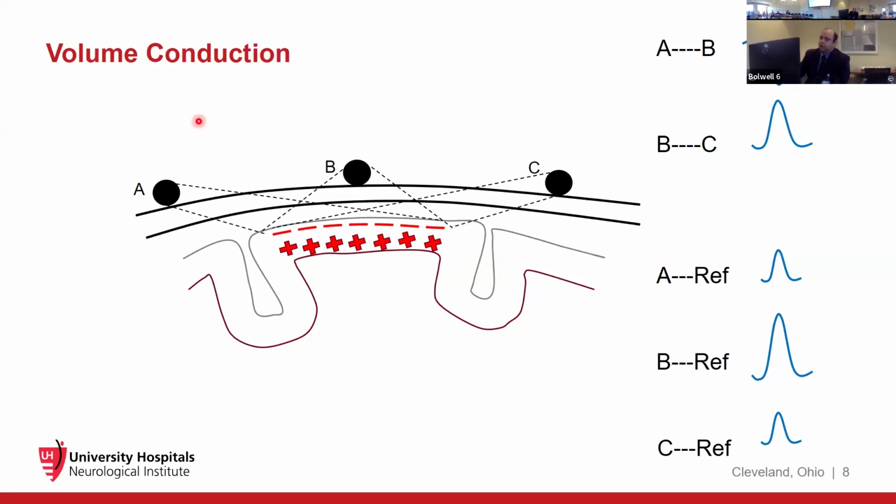What that means is that when you have a cerebral source of EEG, when a wave is being recorded from a cerebral source, the electrical field and the electrical potentials are conducted across the entire volume of the head. And for practical purposes, we assume that the head, including the skull, soft tissue, and the brain, is a homogeneous volume conductor. The example I give to the course participants is we all record EKG all the time, right? You have the limb leads and the precordial leads, right?